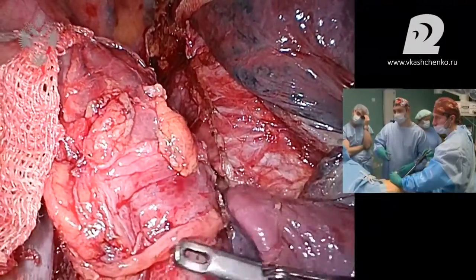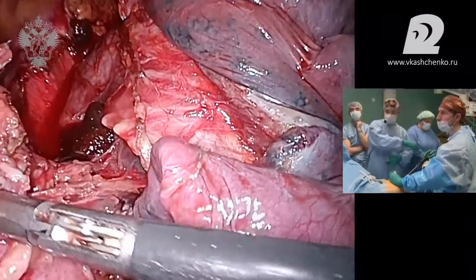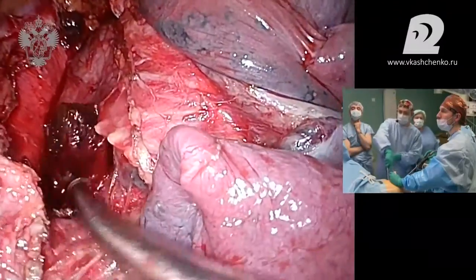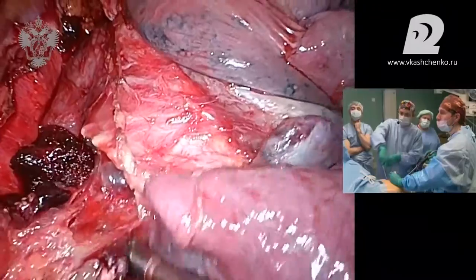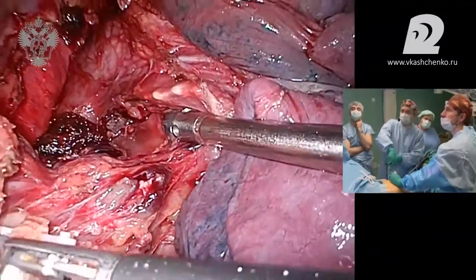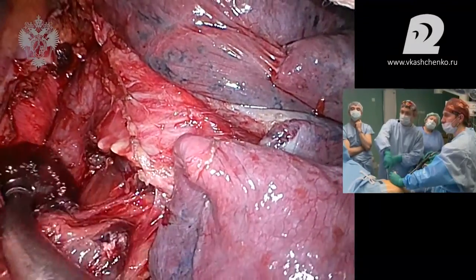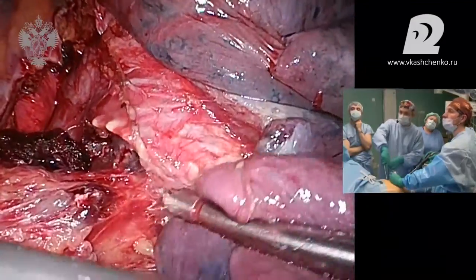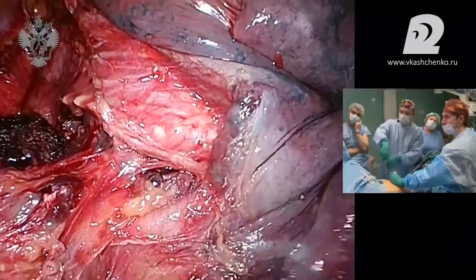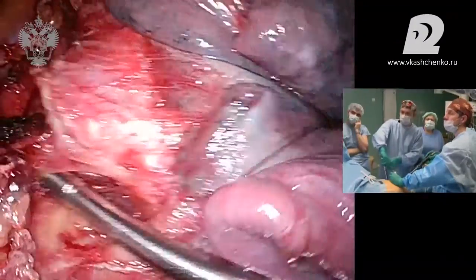Could you show me where this tumor is attached to? So here it is. It is attached to the nodes. It's under the bronchus, the intermediate bronchus. We can see the right main bronchus. The ends are sticking out from the bifurcation zone, lower, downwards, and that's how it is attached. And we'll take it in between the vein and bifurcation.